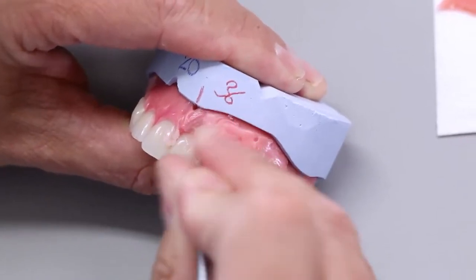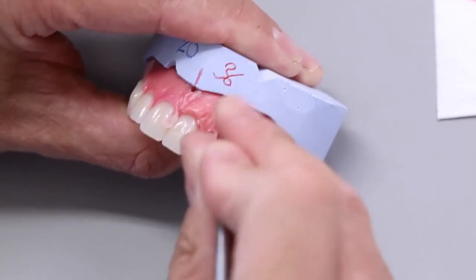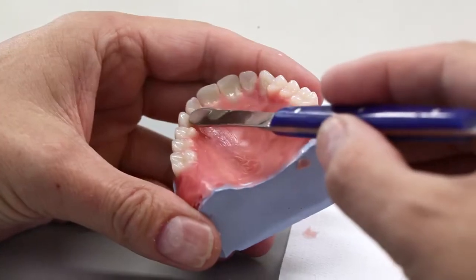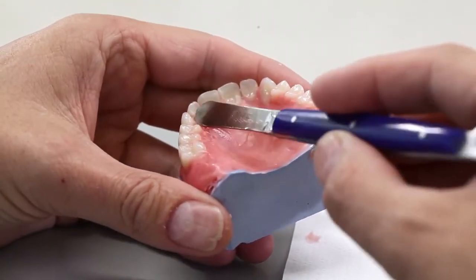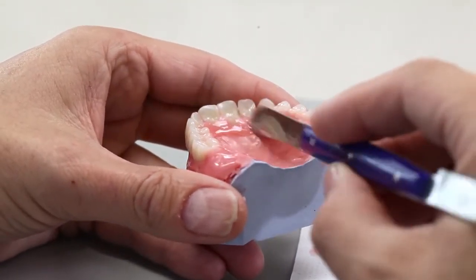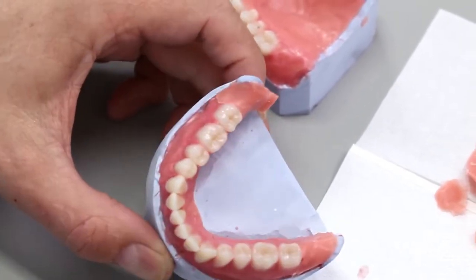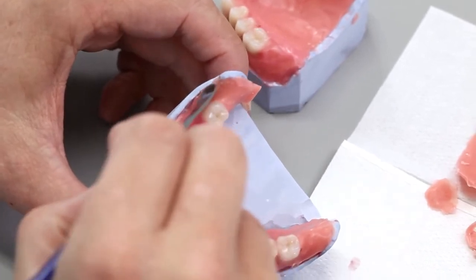Slightly outline the course of the root in a true-to-nature manner. Create the corresponding freeway space for the labial and cheek frenulum. Avoid small concave areas as they can be difficult to clean by the patient. Embrace tubera and trigona as they assume important support and holding functions.